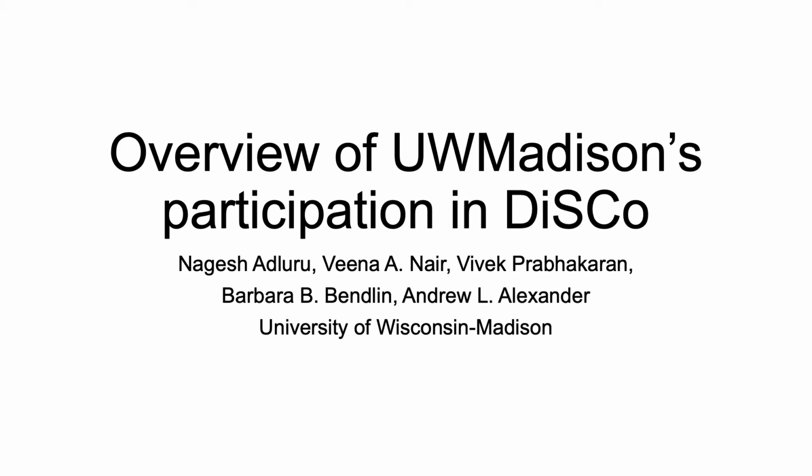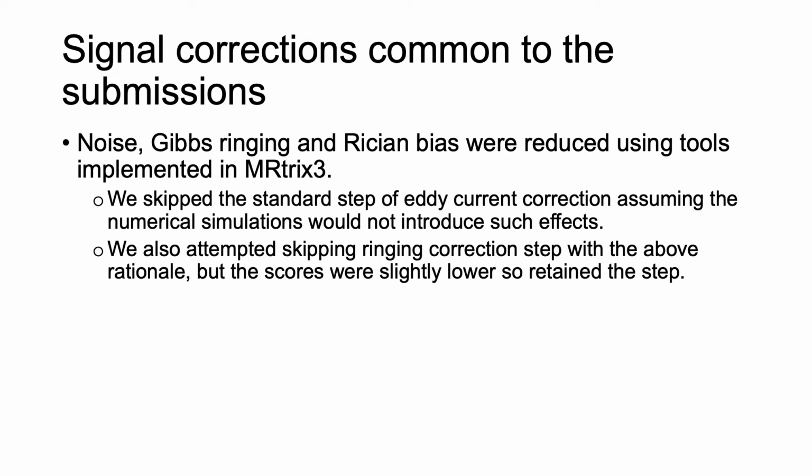We present a brief overview of the team UW Madison's participation in the DiSCo challenge. We performed standard signal corrections by reducing noise, Gibbs ringing, and Rician bias using the tools implemented in MRtrix. We skipped the eddy correction step, assuming numerical simulations would not introduce such effects.